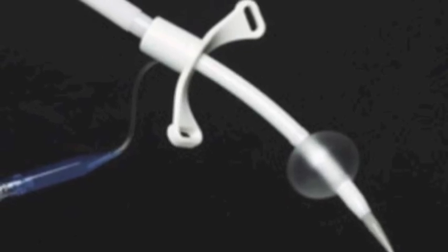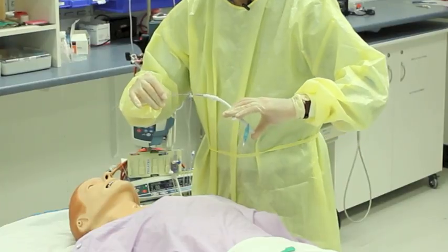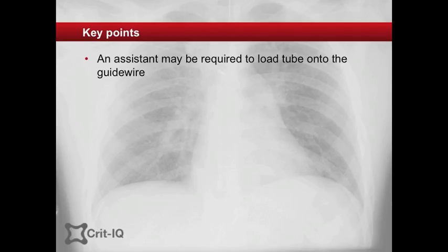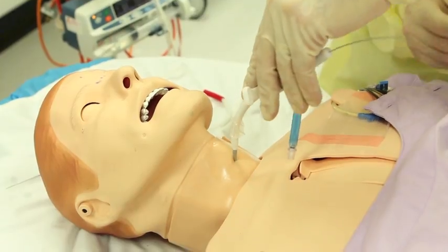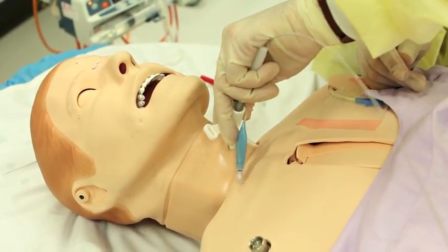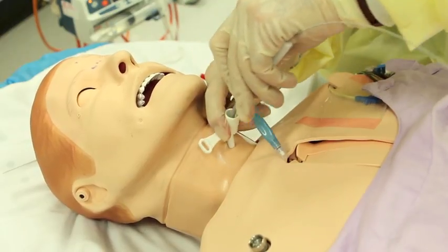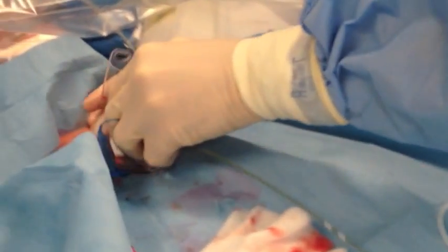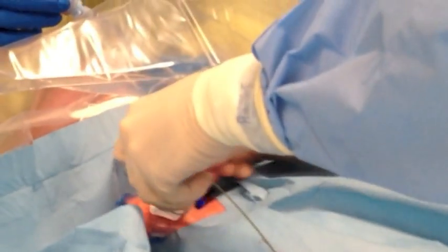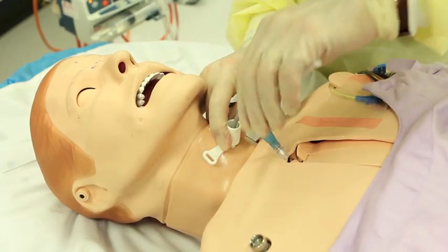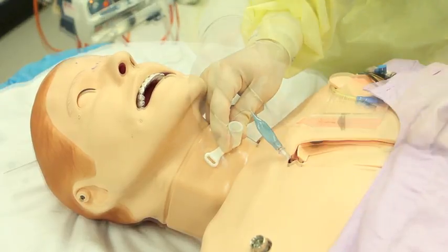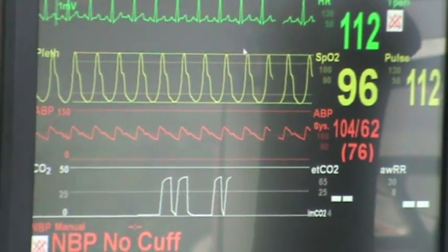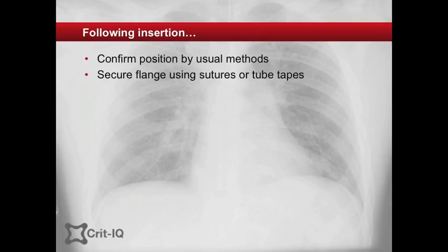The cricothyroidotomy tube, preloaded onto the dilator, is then fed onto the guide wire. Assistance may be required as ongoing control of the precious guide wire is essential. The tube can then be advanced over the guide wire into the airway using a rotating hand motion. The tip of the tube should be almost perpendicular to the membrane as it starts to enter the airway, before a downward rotation carries the tip towards the carina. Once in place, the dilator and wire are withdrawn as one and the cuff is inflated. The position of the tube in the airway is confirmed via standard methods and the flange is secured before connecting the patient to the ventilator circuit.